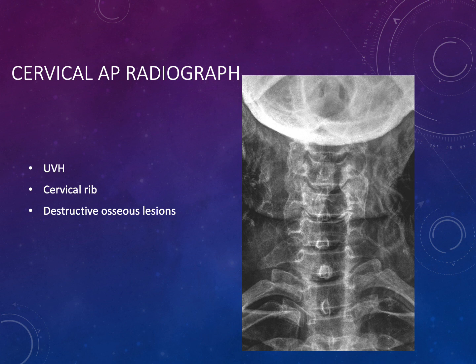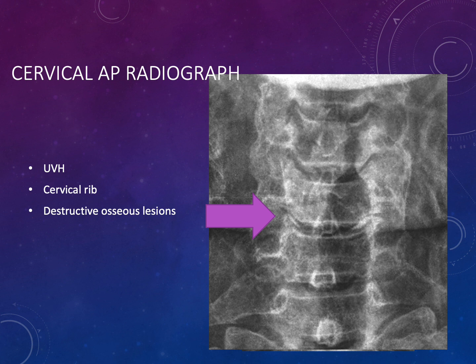The frontal cervical radiograph is a good place to start looking for the cause of pain. Here, the area to examine very carefully is the uncovertebral joints. The lateral aspect of the superior end plate has a small lip — the arrow points to uncovertebral hypertrophy — which is a common cause of impingement on the foramen and the exiting nerve root. Other things to look for include cervical ribs and destructive osseous lesions.